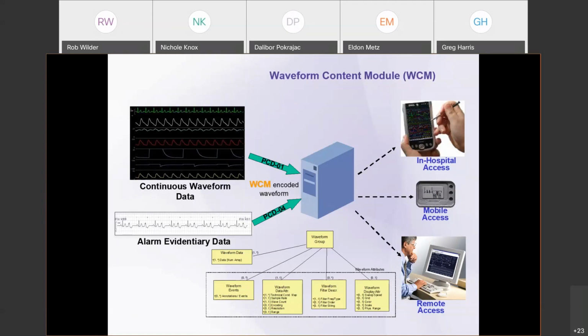The waveform snippet can be added as additional content within a PCD04 message from the AR actor going out to an AM, so it can be incorporated as part of the alert, not a separate message. So using these two methods, remote monitoring of the patient waveforms can be accomplished via workstations or alternatively via smart mobile devices.